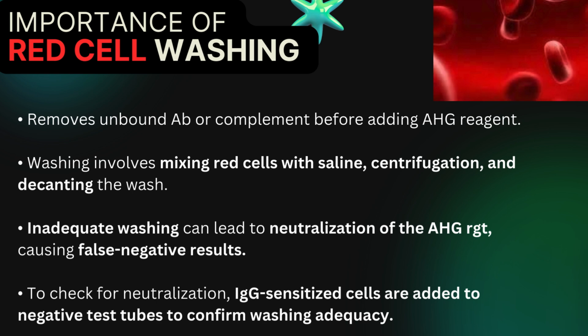So here, importance of red cell washing. Why is this step essential? So first, red cell washing effectively removes any unbound antibodies or complement proteins. So that should be our answer to why you're washing, before adding the AHG reagent.